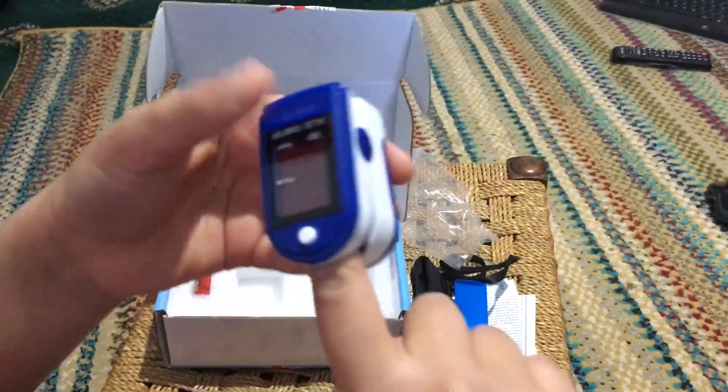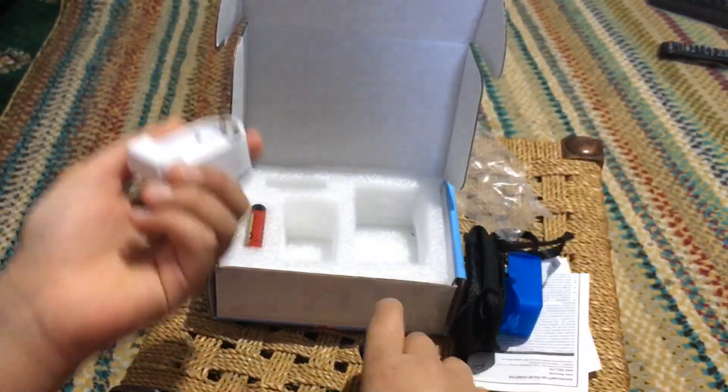So if you want to use it, you actually put it like this - I'll be showing you how to do it - put your finger inside.